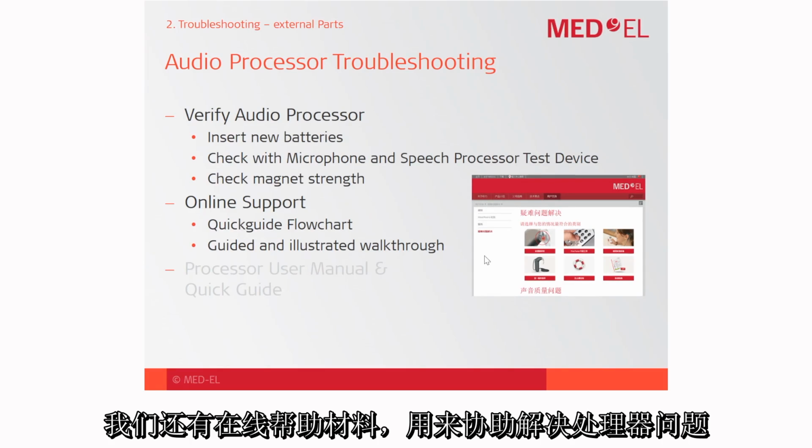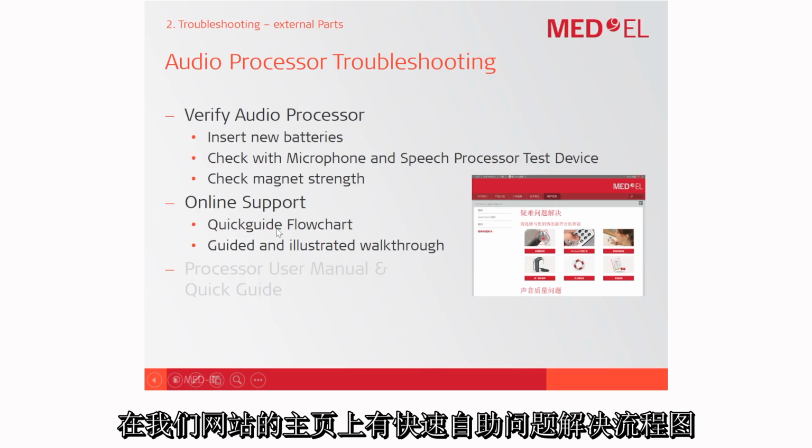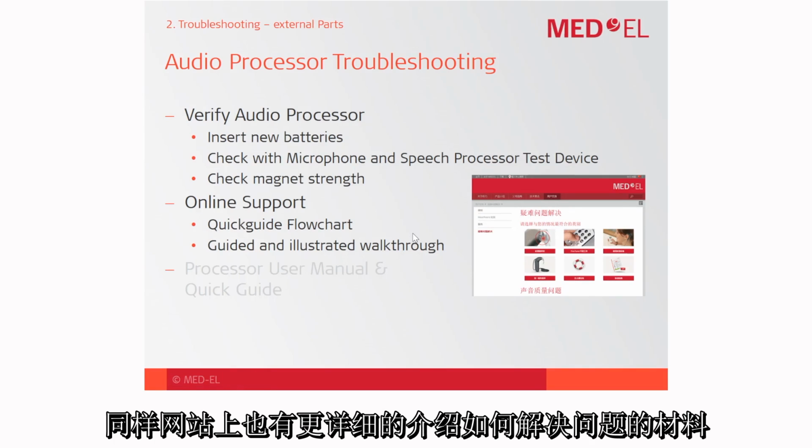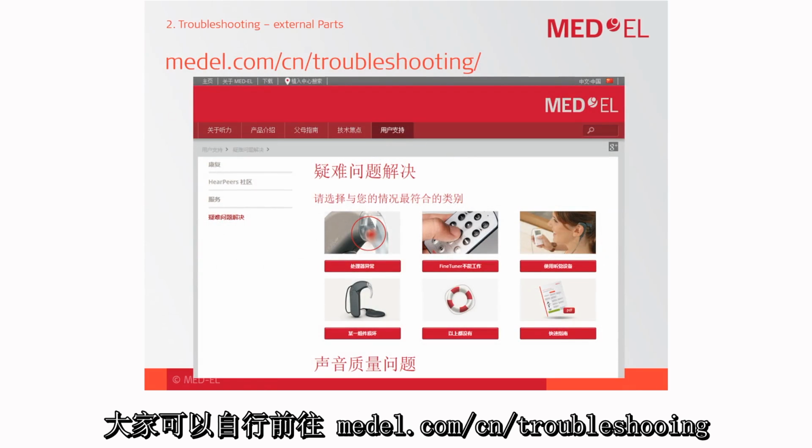So for audio processor troubleshooting, we also have some online support materials. On our homepage there is a quick guide flowchart which could be printed out and gives you a structured solution. Then additionally, we also have a more interactive, guided and illustrated walkthrough available on our homepage. So please go to medel.com/cn troubleshooting to have access to these materials.